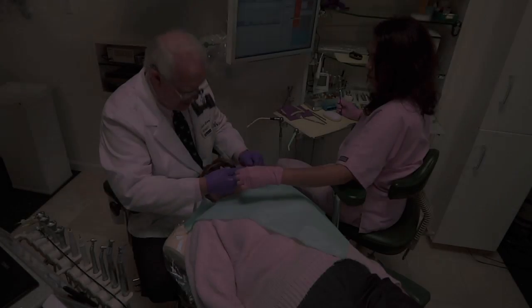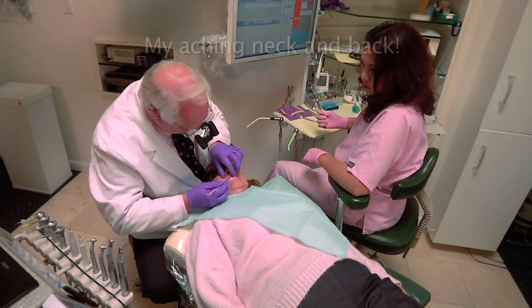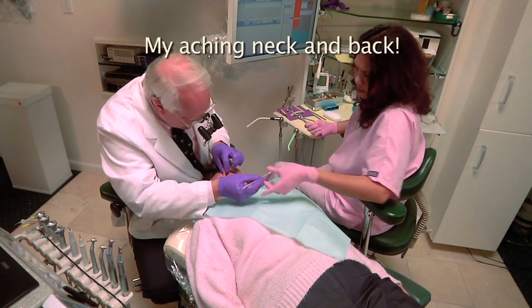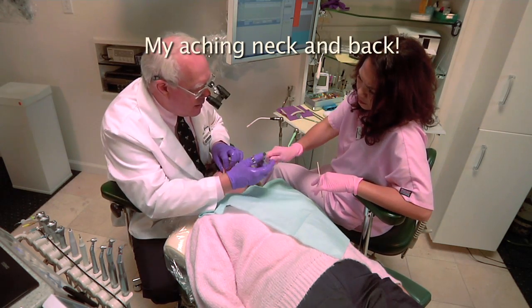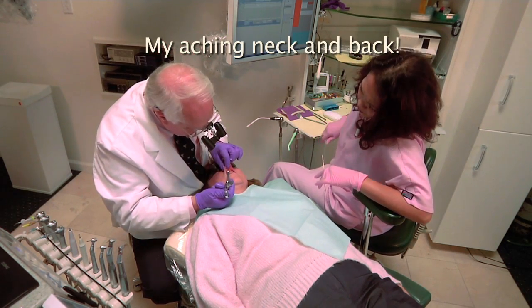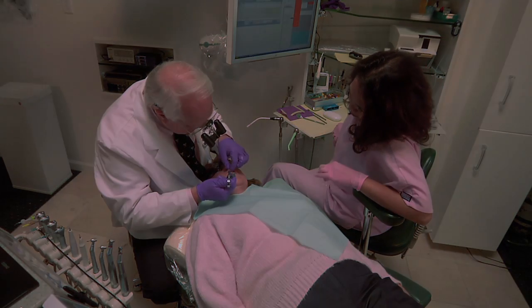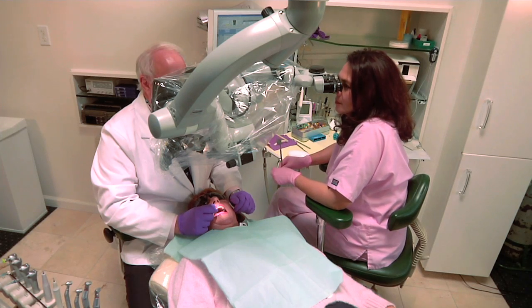There was a question on TDOChad about how to give anesthesia under the scope. Here you can see the typical way it's given in endodontic offices — very poor ergonomics, with pressure at the neck, the back, the elbow, and the arm.